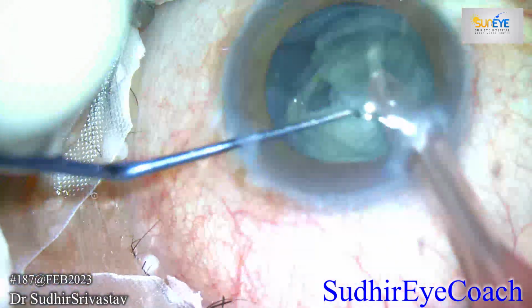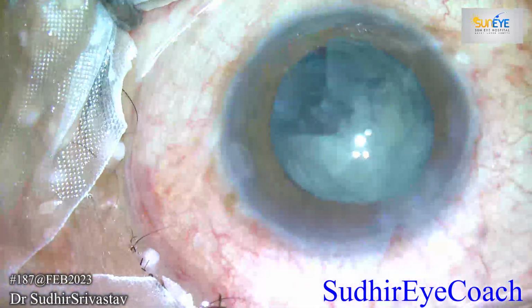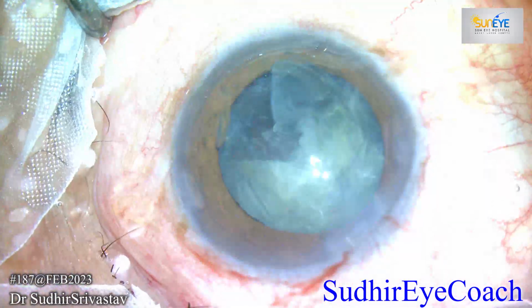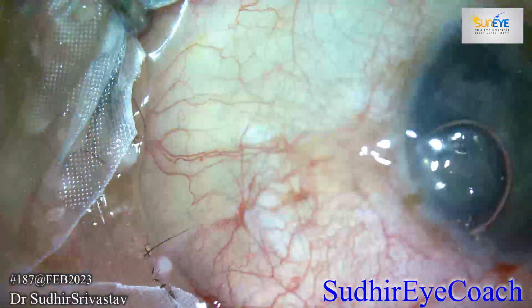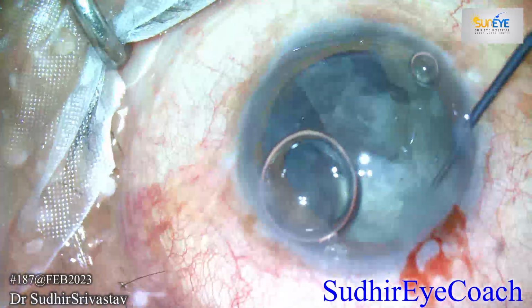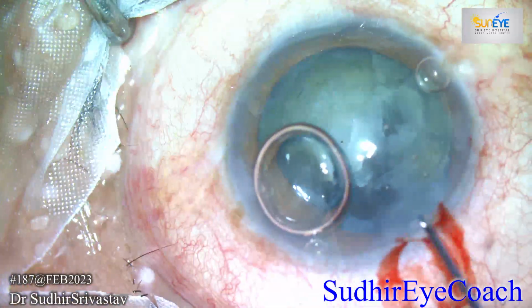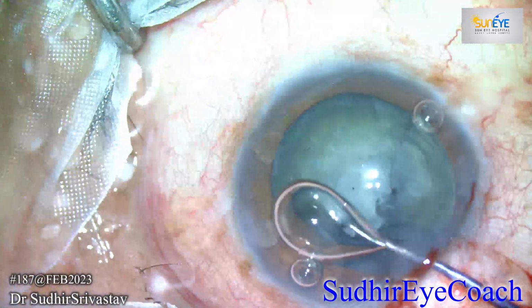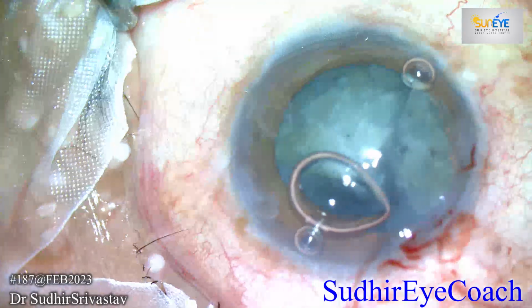Till this stage everything appeared normal, but suddenly I realized that something had happened in the anterior chamber. Suddenly the chamber became deepened and I withdrew, in anticipation that something had happened to the posterior capsule. So I filled the anterior chamber and then gradually rotated the nucleus, because in cases of posterior capsule rent, the rotation of the nucleus becomes difficult.